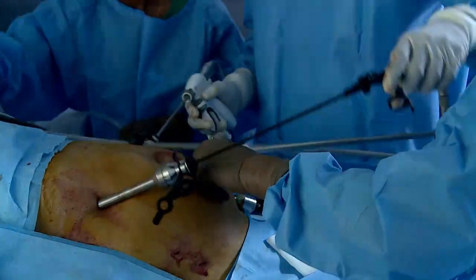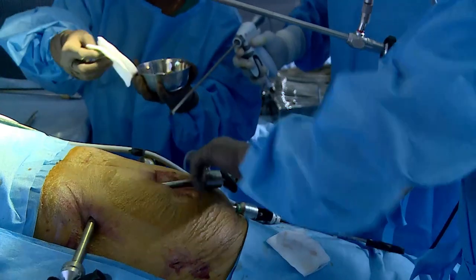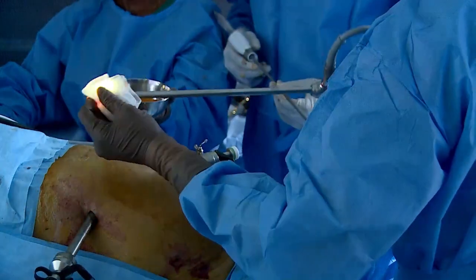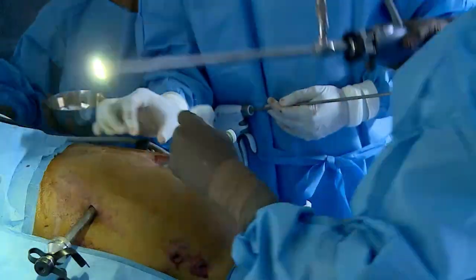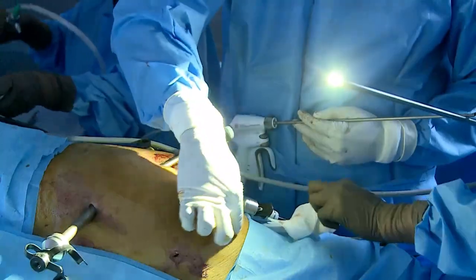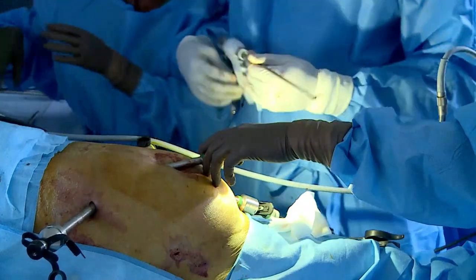And now that the external view is on, there is one question about where you will want to put the incision for the extracorporeal. Okay, extracorporeal always in the upper midline. Just mark that out with your finger. This is the umbilical port. Yeah, 5 cm here. If you have done an adequate ileocecal mobilization, this ileum should come here.